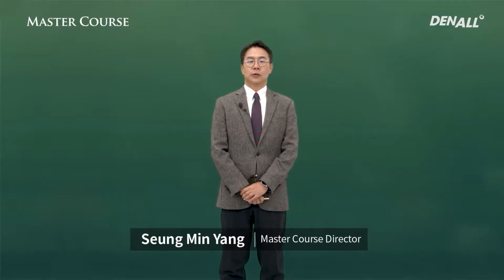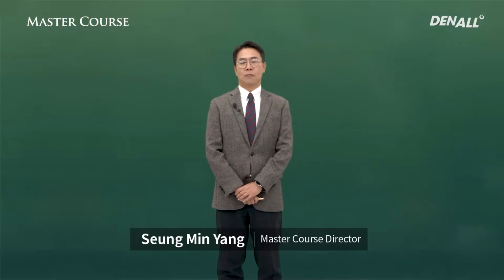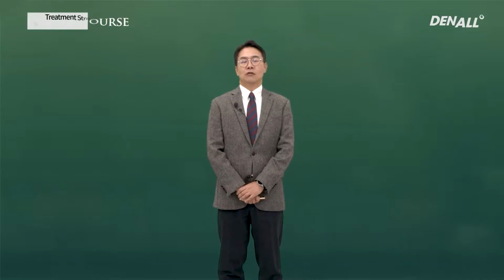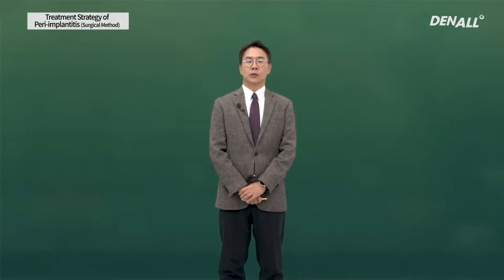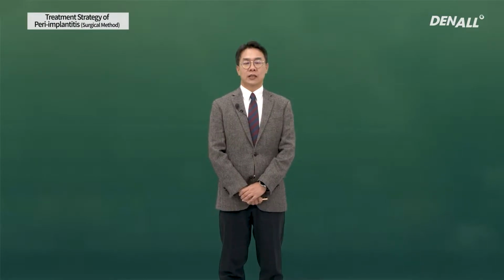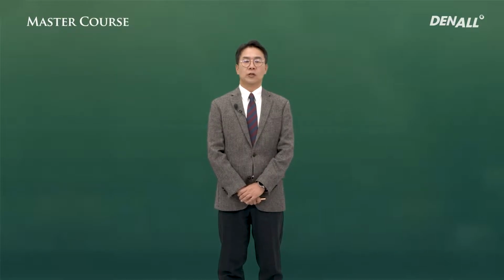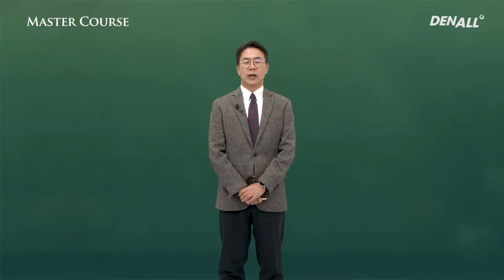For surgical treatment of peri-implantitis, you can do flap surgery or bone graft, and various methods can be used. You need to check the healing response after non-surgical treatment before proceeding with surgical treatment. In this lecture, I'm going to talk about how the surgical method is determined for implant treatment, as well as treatment options.